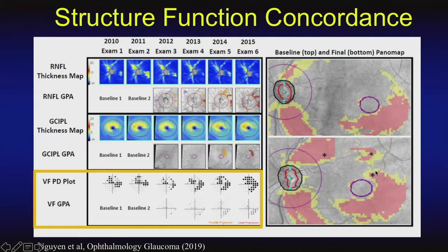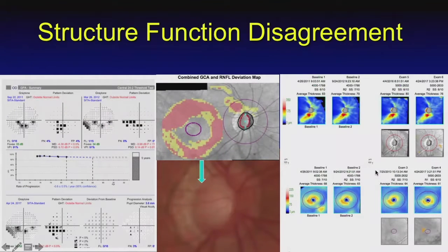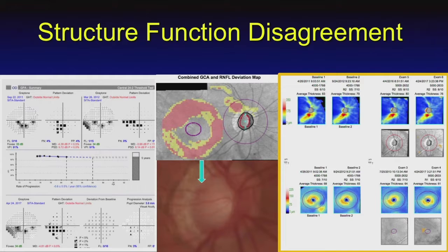identifying this gradual atrophy. This is what I see more commonly in my clinical practice: an eye with advanced glaucoma, where there was progressive visual field loss, and over the course of 6 years of follow-up, there were serial optic disc hemorrhages that I've highlighted here with the arrow, and yet during the same 6 years of follow-up, no changes by event analysis detectable in the nerve fiber layer or in the macular region.